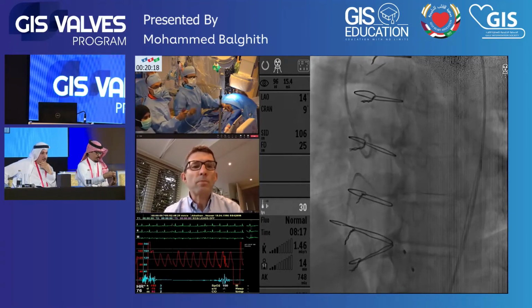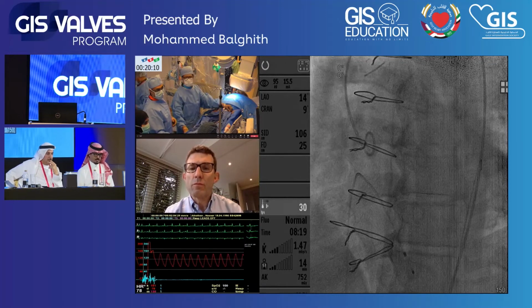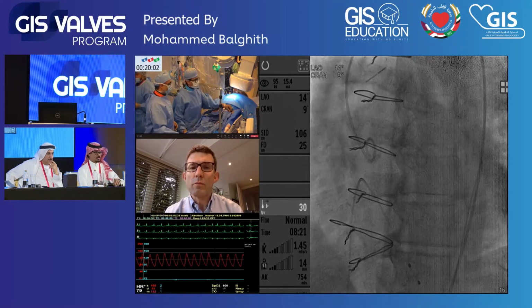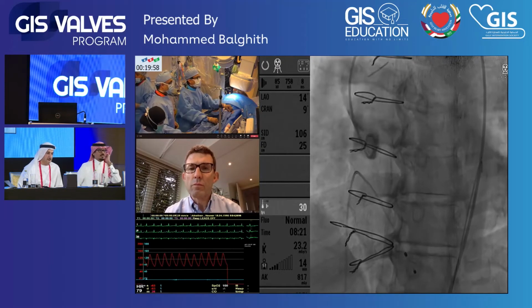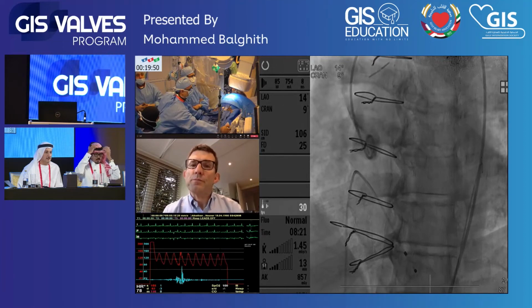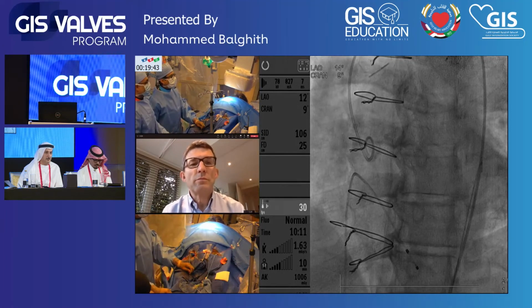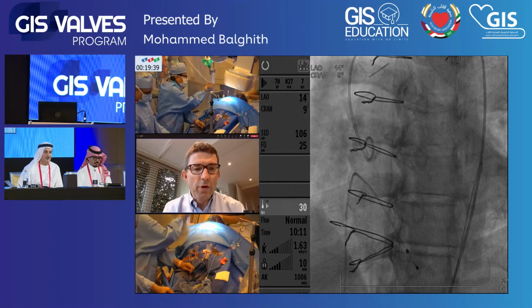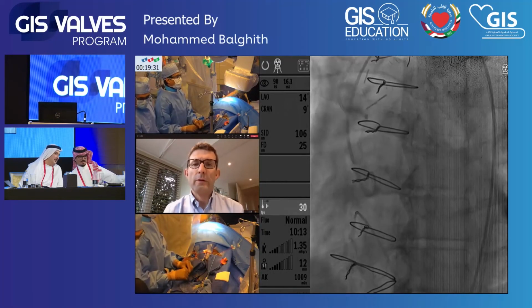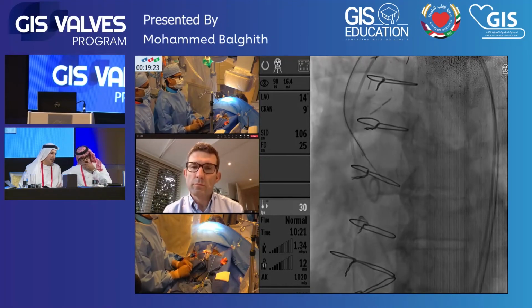What is the total? Make it more. 10? 10, please. The balloon is ready. Okay, we will take a picture. Bismillah. Inject, please. That's a good view. I think that's a pretty reasonable coplanar view. And this is the same view? No. 14.9? Okay, yeah, that's your coplanar view. When the Confida is ready. Yeah, we are there.